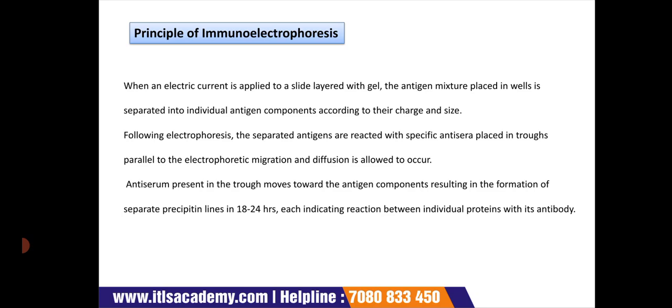Antiserum present in the trough moves towards the antigen component, resulting in the formation of separate precipitin lines in 18 to 24 hours, each indicating reaction between an individual protein and its antibodies. So this is the principle of immunoelectrophoresis. So what is the principle of immunoelectrophoresis?